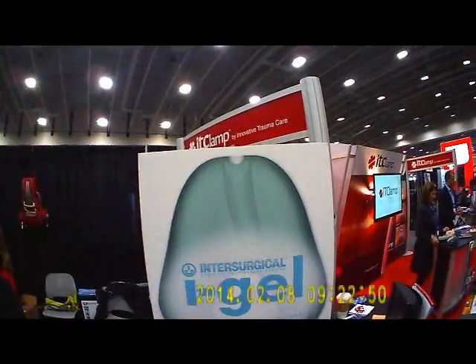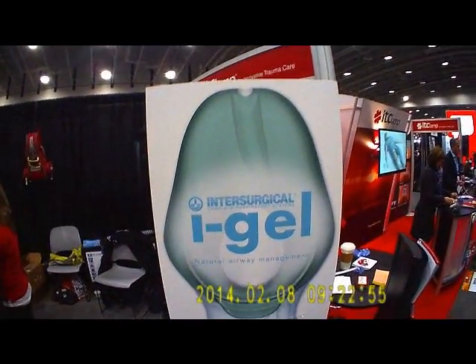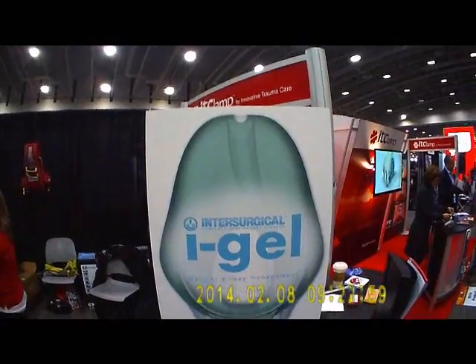Hi, here we are at EMS Today 2014 in Washington, D.C. One of the new products here at the show is the iGel O2 Laryngeal Mask Airway.